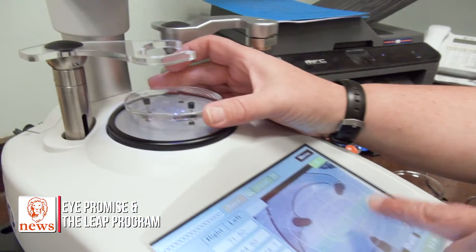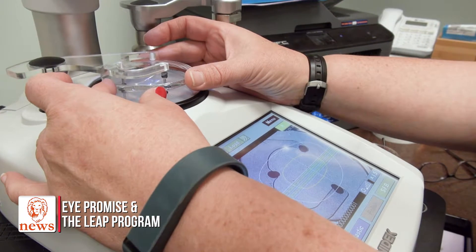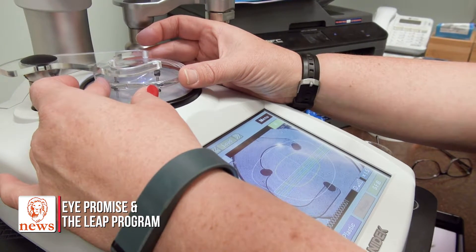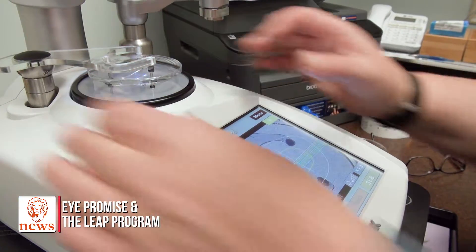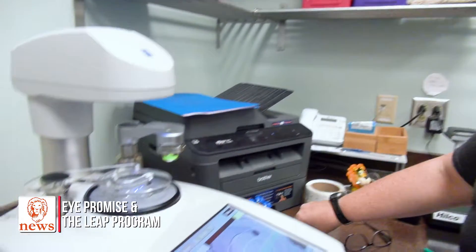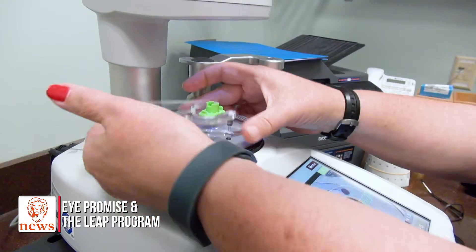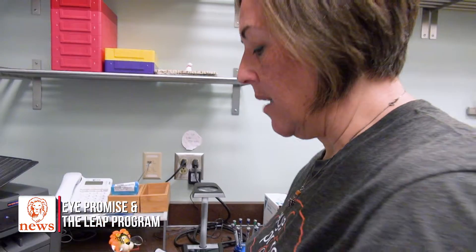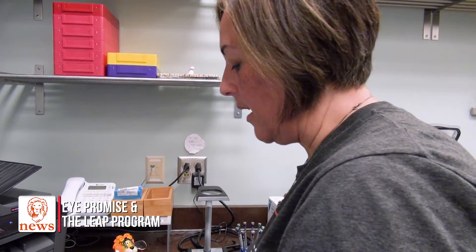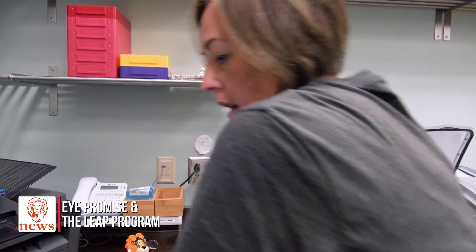We put the lens on — you can see the three dots that I marked. This allows us to line up the exact optical center for these glasses so everything fits nicely in the crosshairs. These are little chucks that we use; they have a sticky back on them and they hold the lens in place in our machine so it doesn't shift when we cut out our lenses.